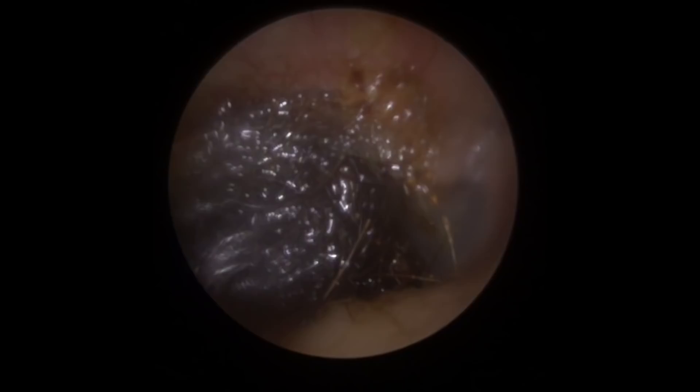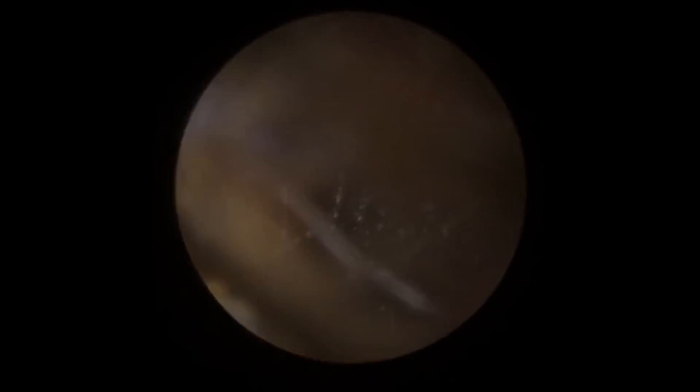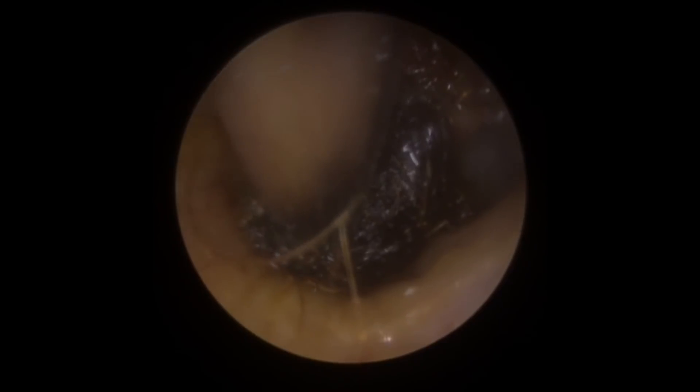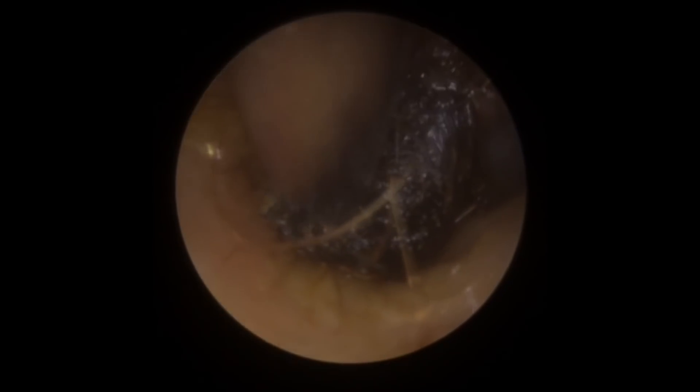You can see this patient has some very very deep-seated wax. The patient works with a lot of fine dust so the wax itself is very hard and very deep-seated. Wax doesn't normally appear this deep in the ear canal — the patient is a self-confessed Q-tip or cotton bud user, so it's pushed this wax very very deep. They've been using a bit of olive oil to try and loosen this up on advice from the GP, but it's so hard and so deep it just hasn't migrated out.